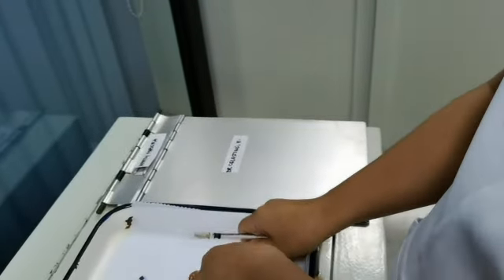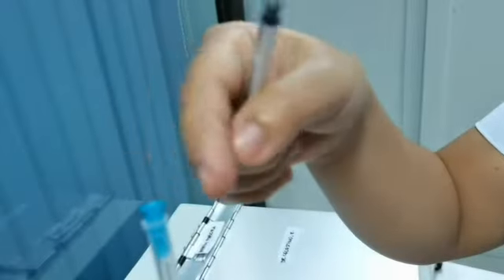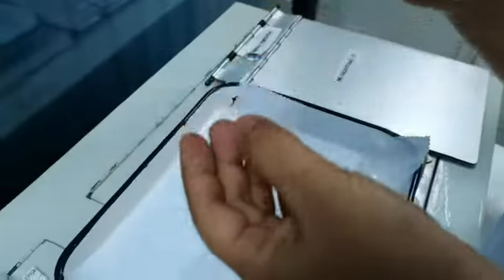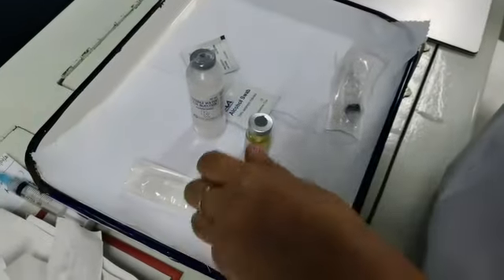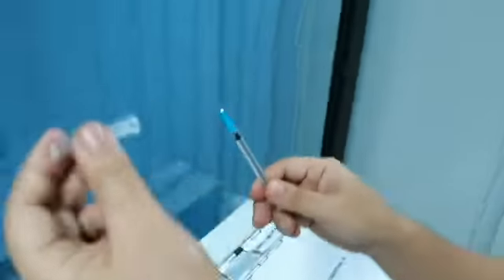So you get another needle, this one. Maintain the sterility of the needle. Do not touch this area or the hub area of the needle. So just hold this area, then change needle. Keep this needle sterile, this hub area sterile. So you can put this inside the wrapper of the syringe because this portion here is still sterile. Then now you can withdraw medication.